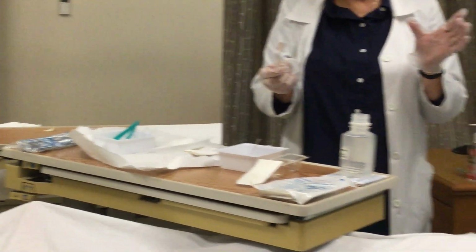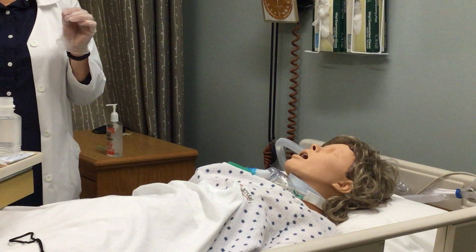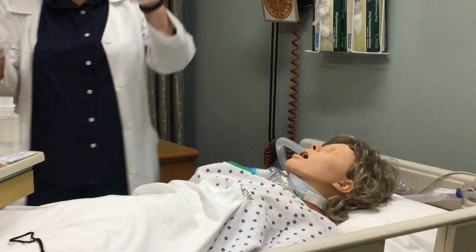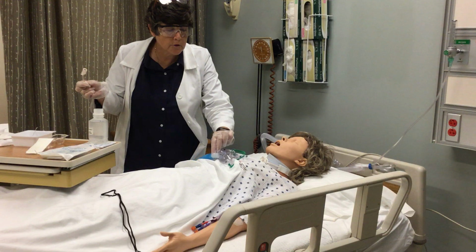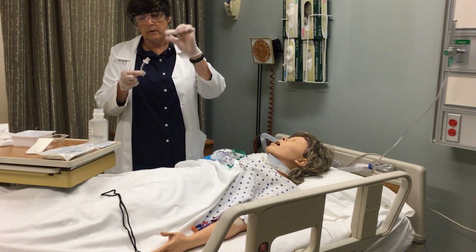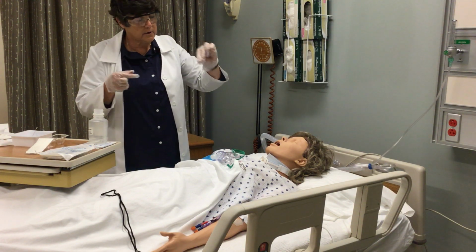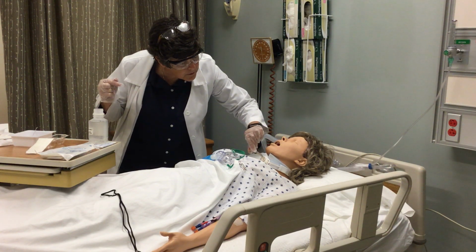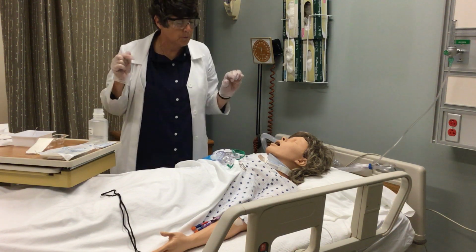Replace the inner cannula and secure the locking mechanism. If necessary, reapply oxygen if needed and hyperoxygenate the patient. So here's my dirty non-dominant hand. I'm going to take Mrs. Cruiser's trach collar away momentarily. Since this part is considered dirty, I'm going to grab it by this part right here and insert it into Miss Cruiser's outer cannula. Miss Cruiser, I'm going to put this back in. Okay, and it's pinched into place.